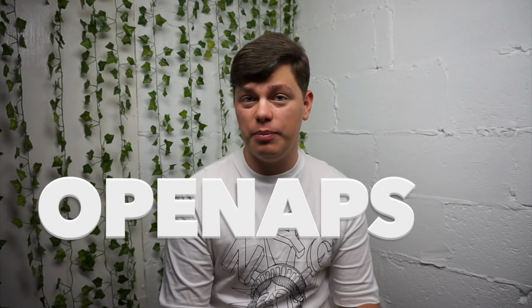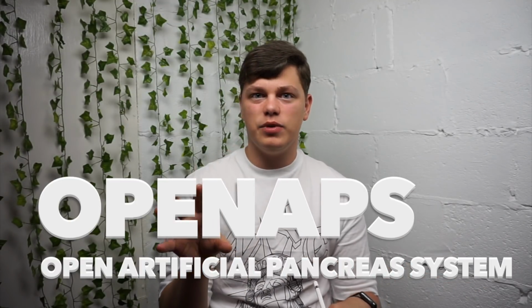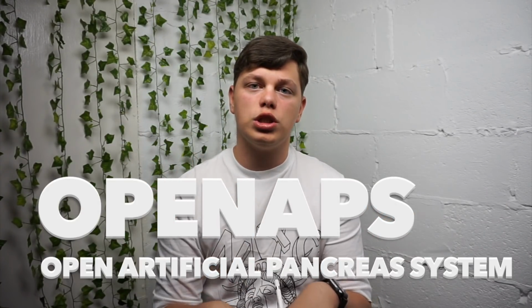Also, looping is only one of a couple of projects that allow you to combine different medical products like continuous glucose monitors and your insulin pumps into one system. The other one is called OpenAPS. There's also Android APS. There are a couple of apps that allow you to combine all of those devices to make a closed loop. And the one I'm using is called Loop.